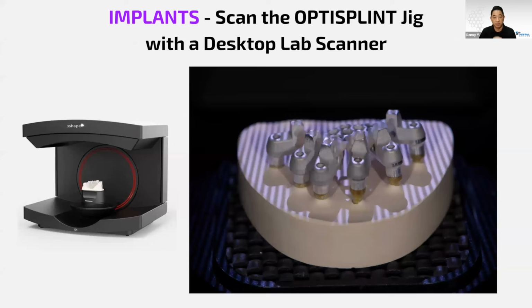And this is what I was talking about with the desktop lab scanner, making sure you scan this jig or this OptiSplint record, the implant records, with the most accurate piece of equipment that you have. The 3Shape scanner that I have here, I believe it has 4 microns of accuracy. There aren't a lot of devices out there that are nearly as accurate as this device in terms of scanning.